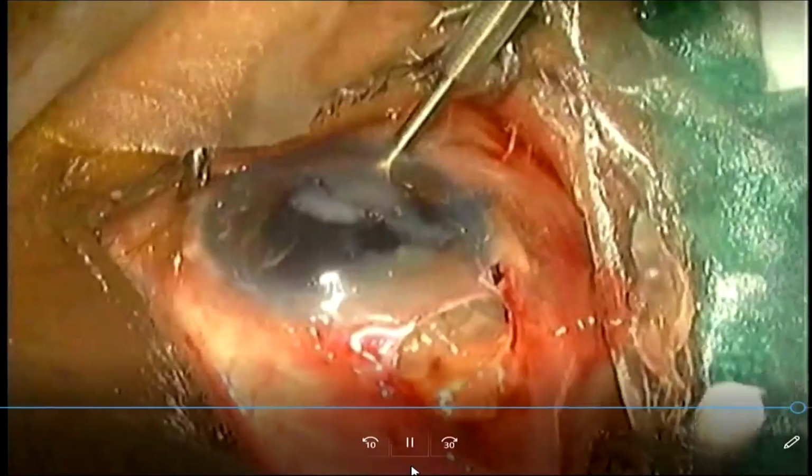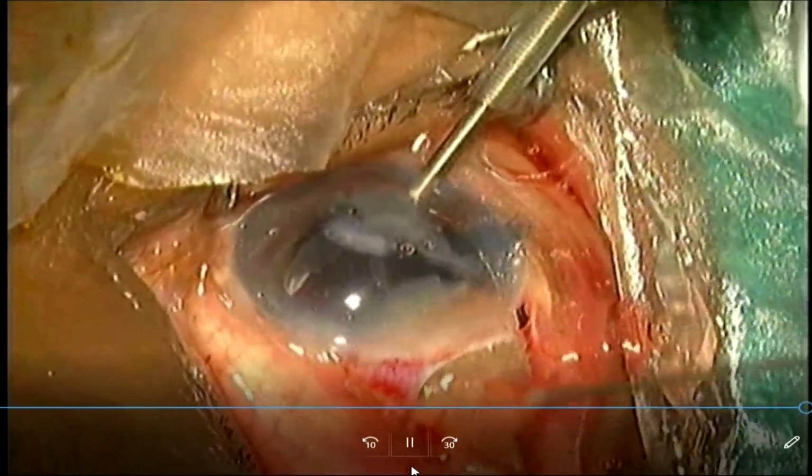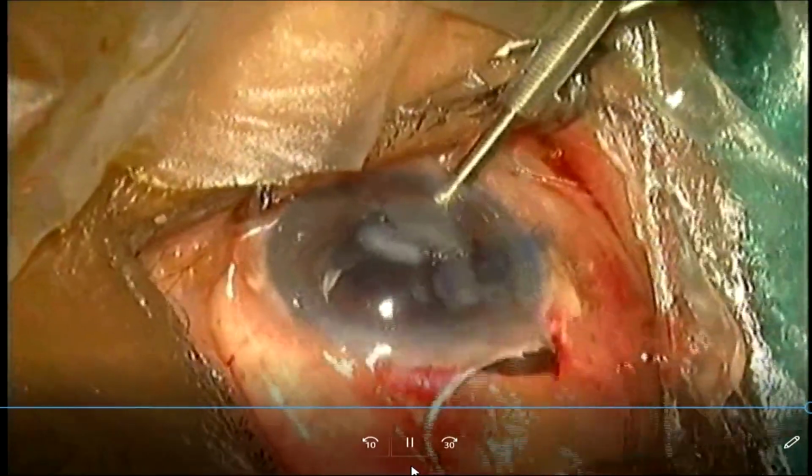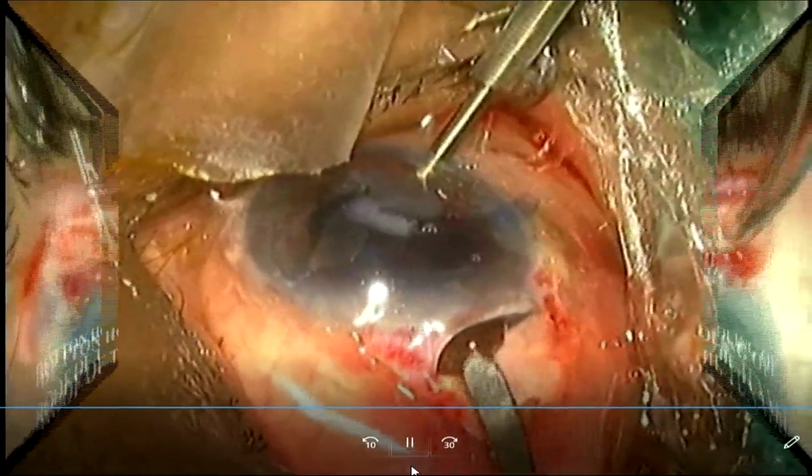See what is happening now. So you just push back the nucleus, put in viscoelastic, re-engage your nucleus and then take it out. Otherwise you will end up with a superior iridodialysis if you keep on doing this.